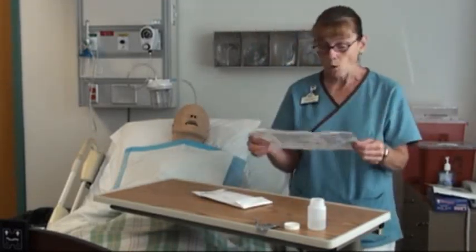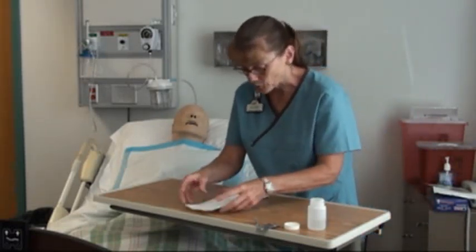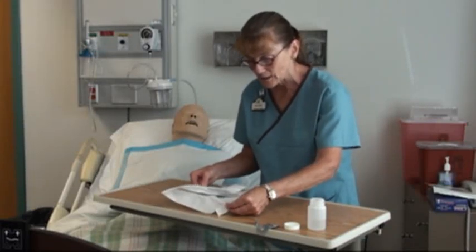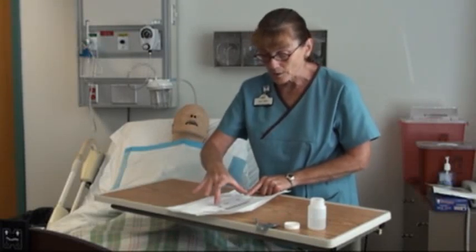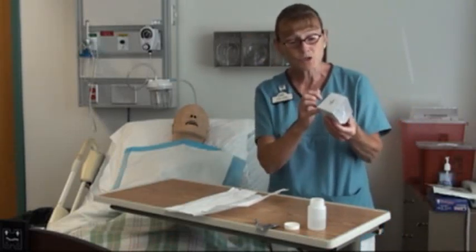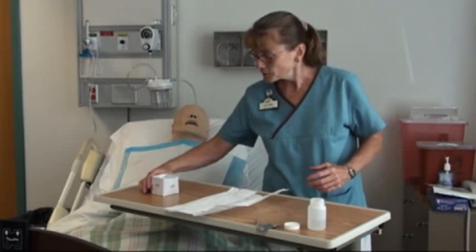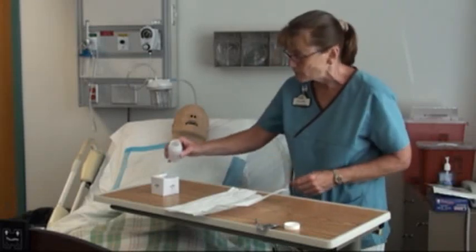This package is in date and there are no openings or puncture marks in it. When you actually open this, you're going to crease the little folds back — there's a one-inch margin that you can actually touch with your bare hands. Other than that, you shouldn't be touching anything inside here with your bare hand. The cup is laying partly over on the contaminated part; pick it up on the side, mash it together, and stay to the side until you can establish which is inside and which is out. I'm going to put it over here because I'll need it to rinse my catheter, and notice I'm coming away from my field, not over it.